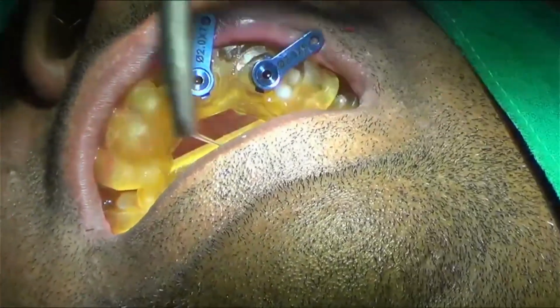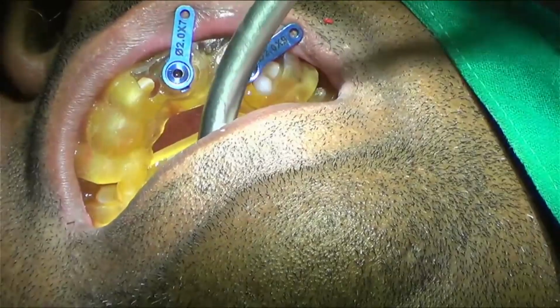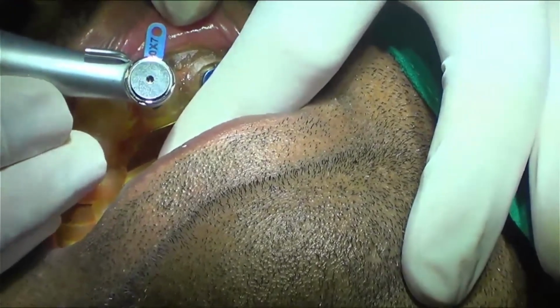So next is going to the 13 mm drill as we are putting the 13 mm implant. So we are going down, engaging the bone again.